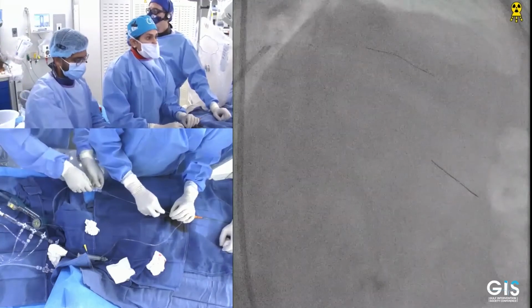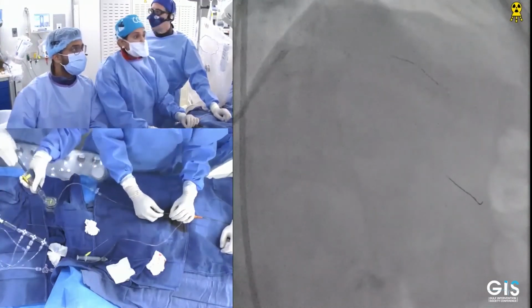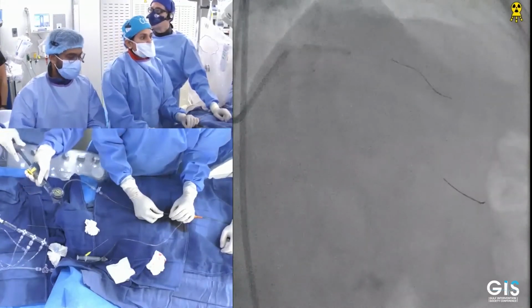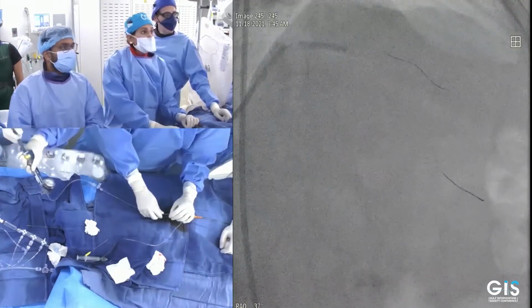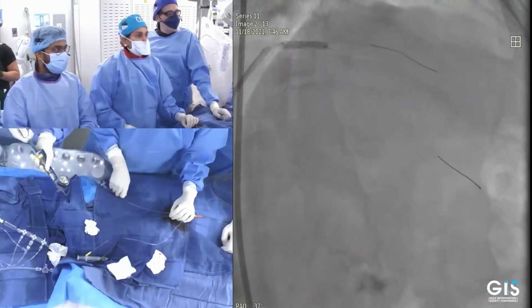What is the comment? Go up. No, it's a little frozen, I think, the volume. But they can see the image, so it's good. 14, 16, 18. Or like 18, 20. If you hear us, okay, I think we lost your volume, but maybe you hear us.